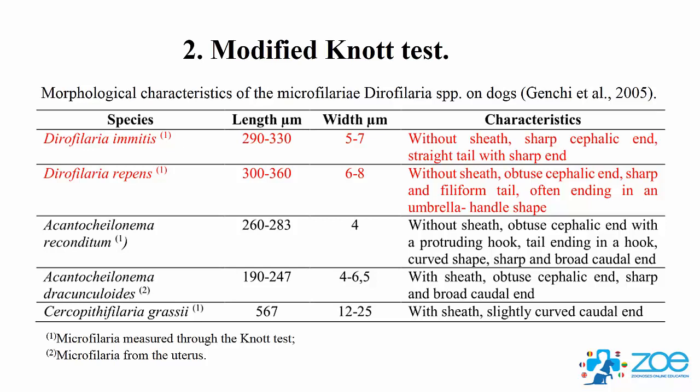Modified knot test. Morphological characteristics of the microfilaria Dirofilaria spp. in dogs.